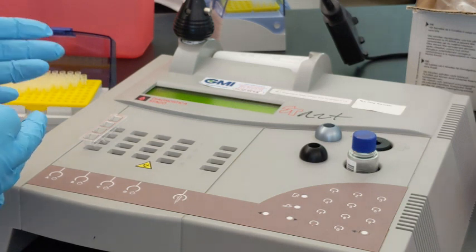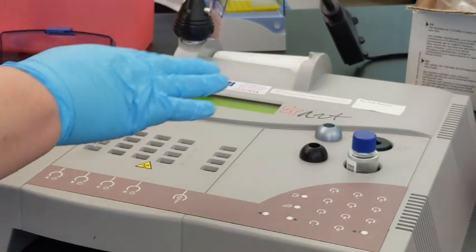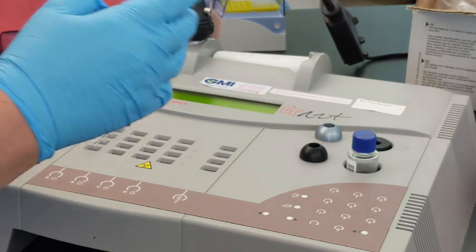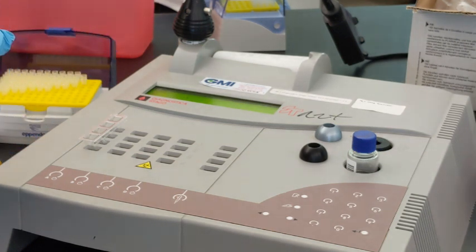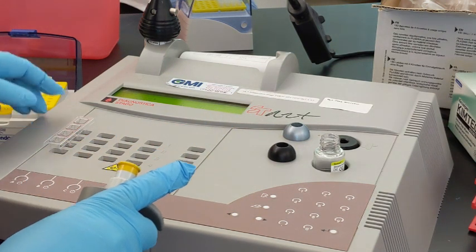In a more computerized or automatic analyzer, all of these steps, you would have actually robotics that are doing the pipetting and setting the time and making sure that everything is at proper temperature. But this analyzer is nice because you get to do the different steps that seemingly magically happen within your typical clinical coag analyzer. So it's now beeping, letting us know that it's almost ready to be tested.